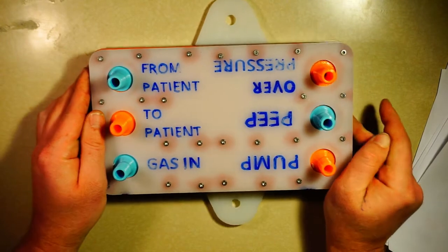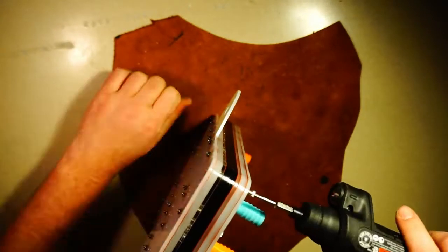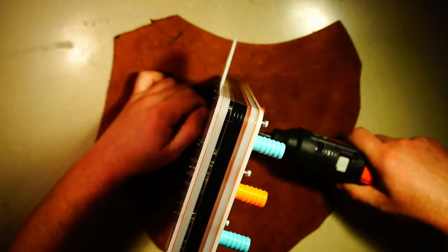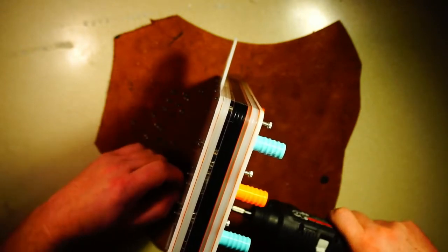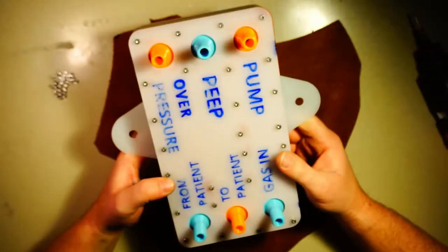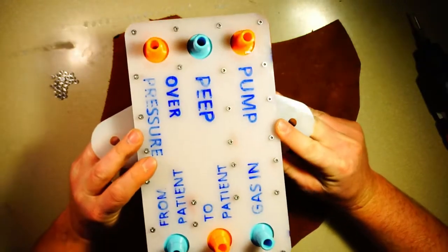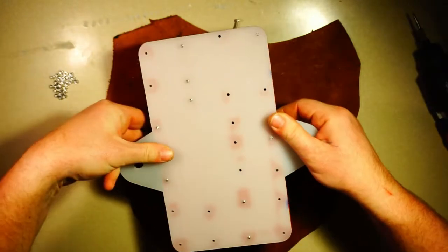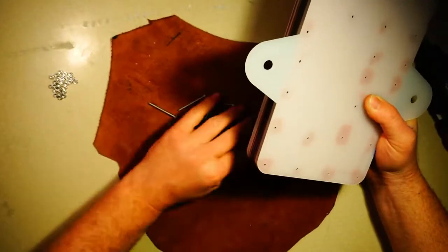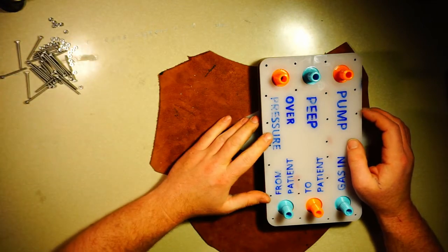So let's disassemble this. Okay, so now I've removed all of the nuts from the gasket bolts. Let's shake the bolts out. Okay, so now let's take a look at some of the layers.